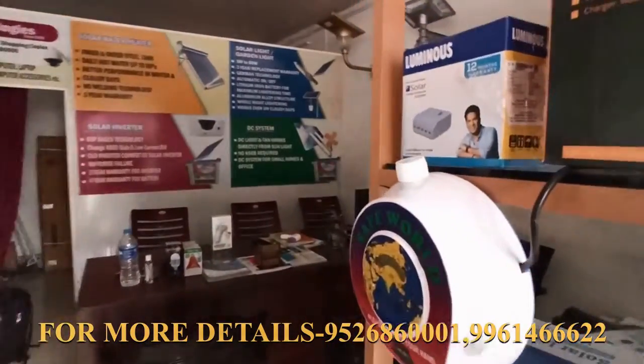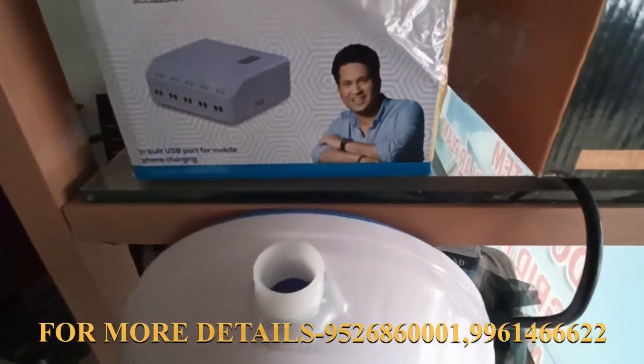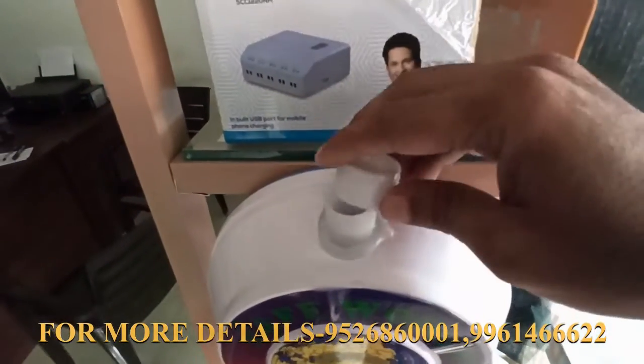We can use this product on refill mode. We will use the liquid mode to operate it, and it uses electricity.